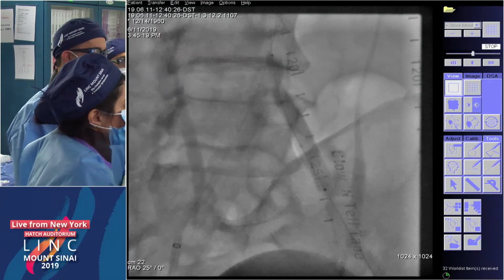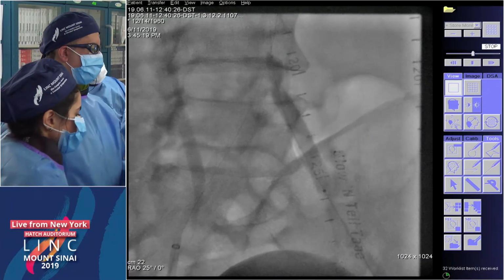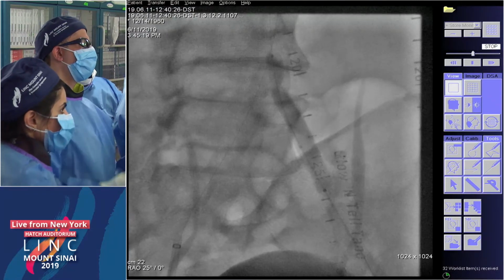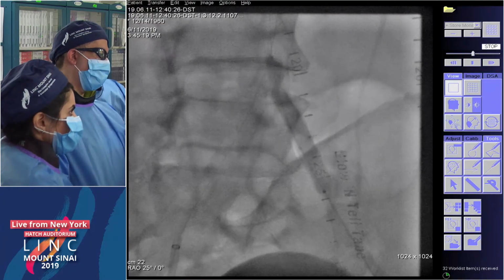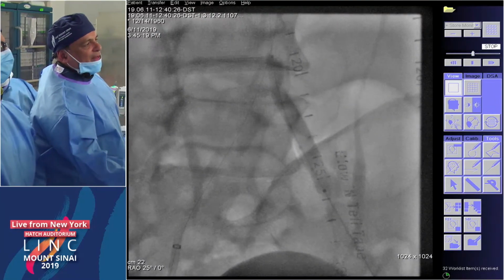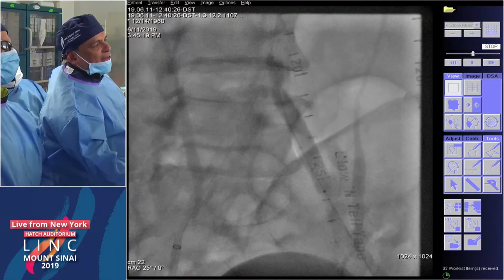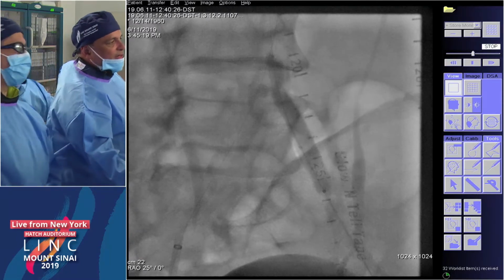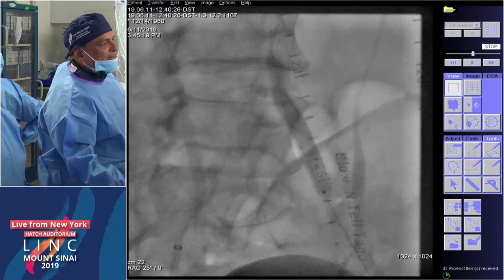So right now we're at 2, Jim, and you can see the tightest lesion is at the common. And now as it's going up, you're going to see it start to expand, as you see right now. And it goes to low pressure at 2 and then a little bit higher at 4. I've got my glow tape, which I know I'm in the aorta with that. See, they're starting to expand now even better. And right now we're at 25 seconds, and we're going to do another treatment there. See it expanded? Right there. So it expands quite nicely without having to go to high pressures. So we're going to go up to 4 atmospheres now, and then we're going to go ahead and do it one more time, and I'm going to pull it back.